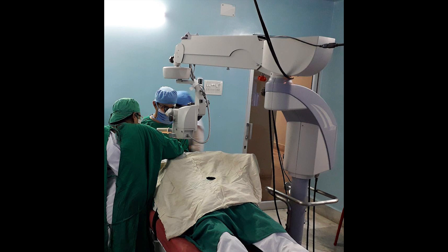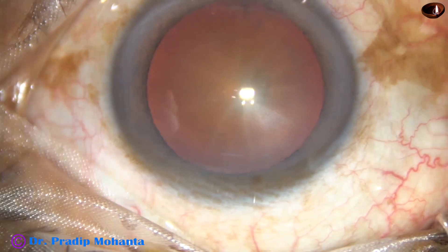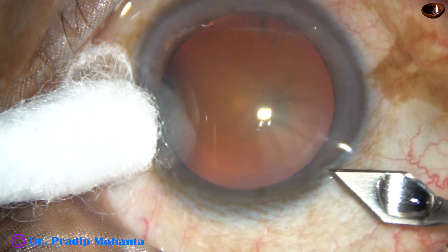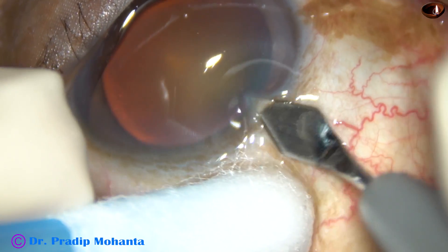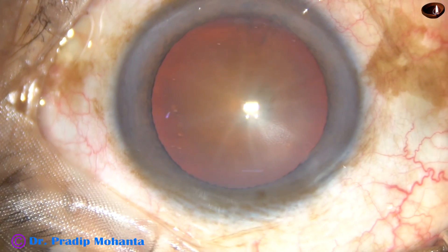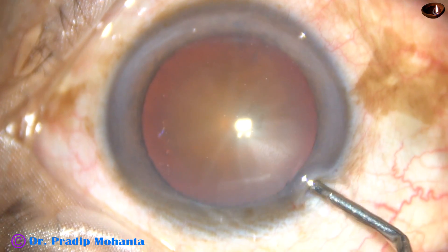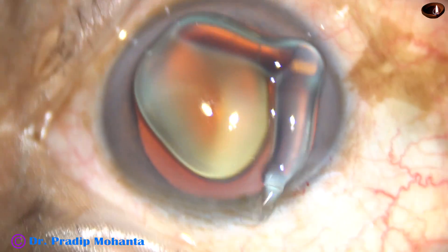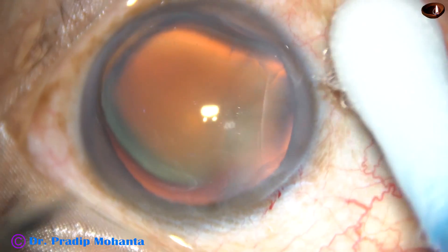Let us see a routine surgery with this microscope. This is a cataract with grade 3 nuclear sclerosis. This is the main incision with a 2.8 mm keratome. You can see the red glow is quite good. 2% hydroxypropyl methyl cellulose has been injected into the anterior chamber and HPMC is applied over the corneal epithelial surface.